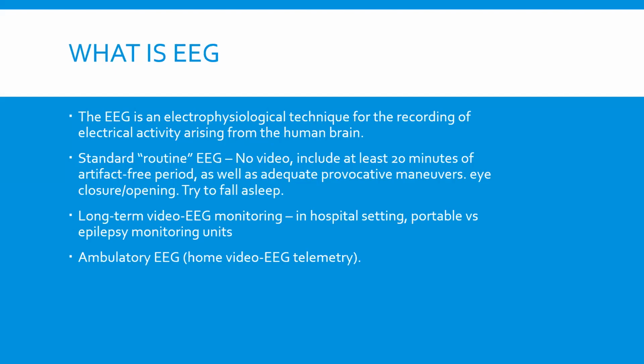So I'm going to talk about first, what exactly is an EEG. It's an electrophysiologic technique for recording electrical activity from the human brain. And you guys have ordered different tests.